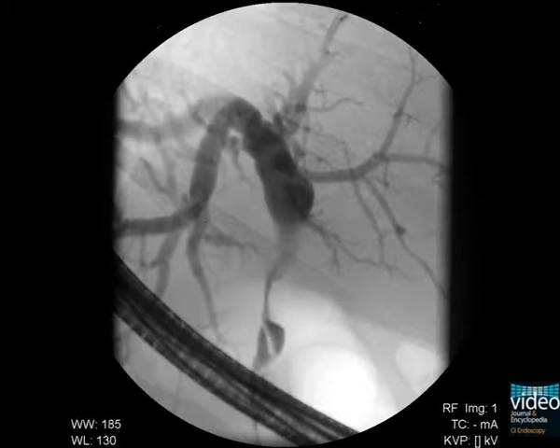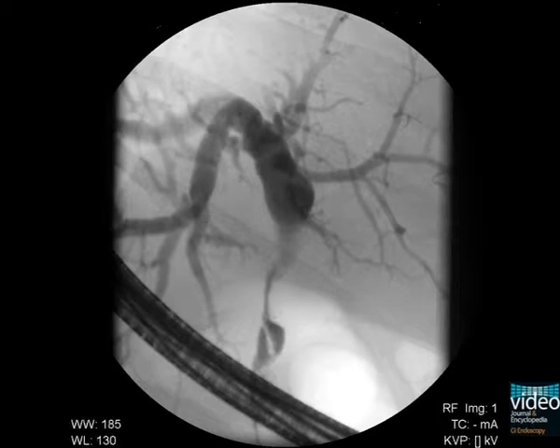A young patient with jaundice showed an unclear obstructing mass in the upper portion of the common bile duct at ERCP. A novel technique called direct cholangioscopy is performed with an ultra-slim endoscope to evaluate the lesion.